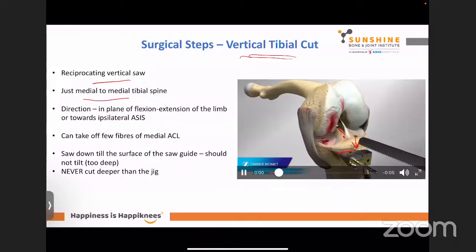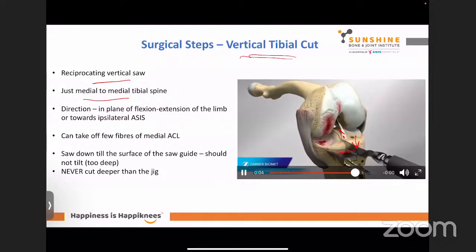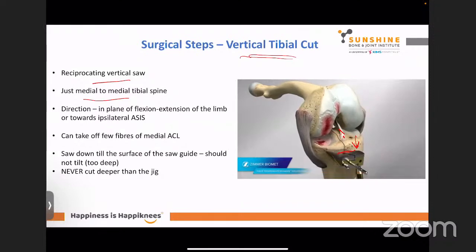So this is what it looks like. You saw where it comes in. Then you go straight down until you reach the top surface of the jig. Okay, that's a vertical tibial cut.